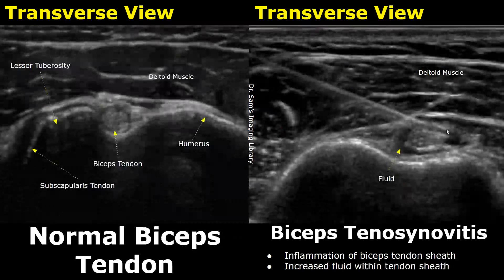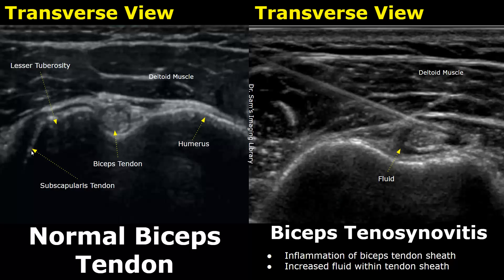Here is an image of a normal biceps tendon in transverse view — more specifically, the long head of the biceps tendon. It looks like a round hyperechoic structure. This is the humerus, over here is the subscapularis tendon, this is the lesser tuberosity, and up here is the deltoid muscle.